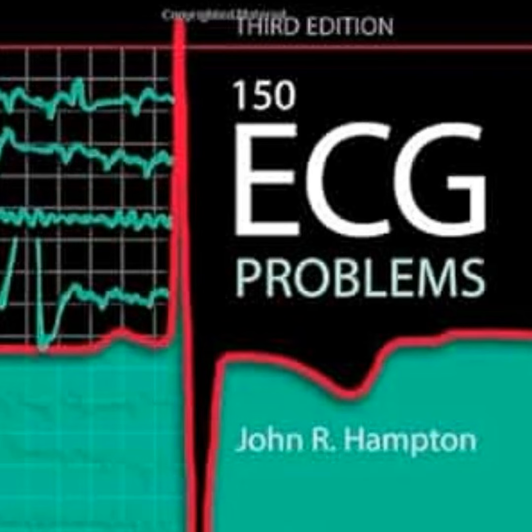Okay, yeah. Like the voltage criteria for left ventricular hypertrophy, or LVH, that is a perfect example of it. It really is. Because you look at the precordial leads, right? And the S wave in V1 plus the R wave in V5 is, say, well over 35 millimeters. Huge spikes. Massive spikes. On paper, it absolutely meets the textbook Sokolow-Lyon criteria for LVH. Sure does. But Hampton argues, if this tracing belongs to, like, a 20-year-old, totally asymptomatic university student who is thin and active, this is highly likely just a normal variant.